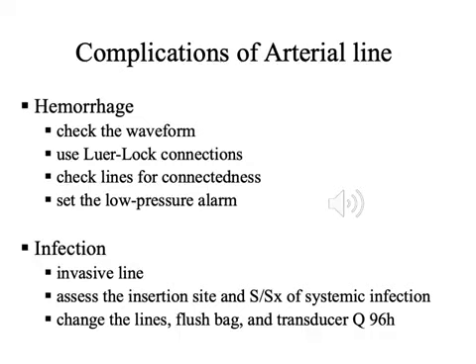As for infection, we need to make sure we apply sterile technique during catheter insertion, when we do care for the insertion site and blood sampling. We should maintain sterility to prevent infection.